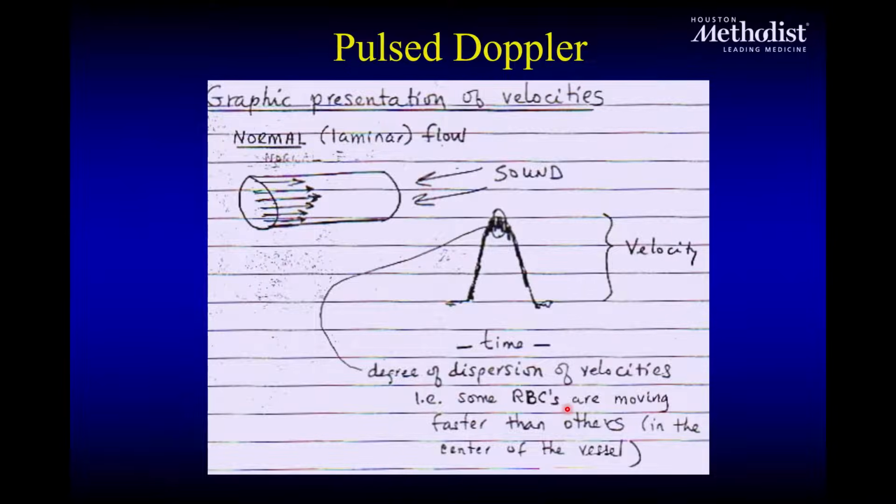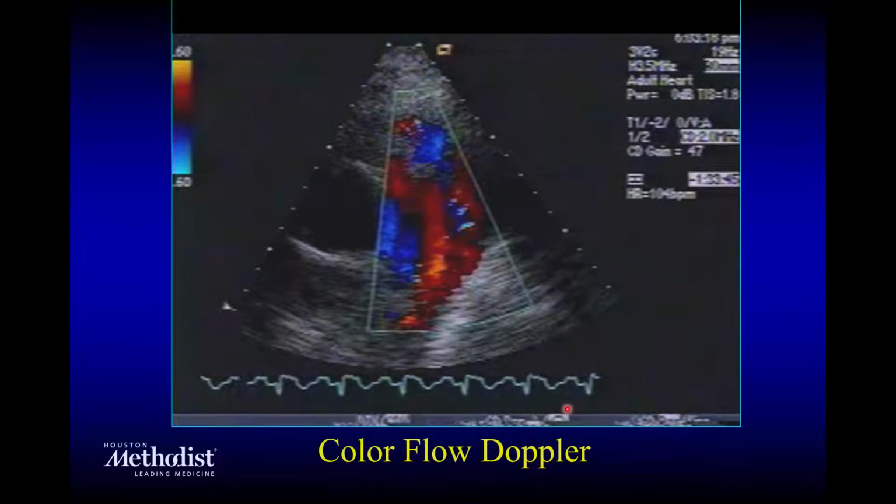Okay? So color Doppler is basically a different form of pulse Doppler. And instead of just having one tiny area of a gate, you have a multi-gate approach. Now, the toll of this is that it takes time, and also there is a decrease in accuracy for you to be able to resolve all these tiny little multi-gates along the line of the color Doppler.